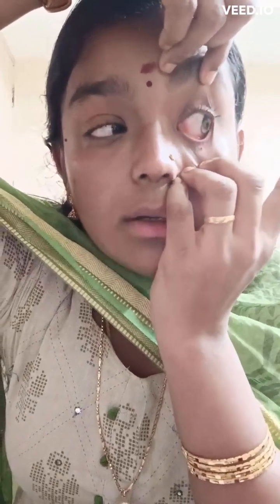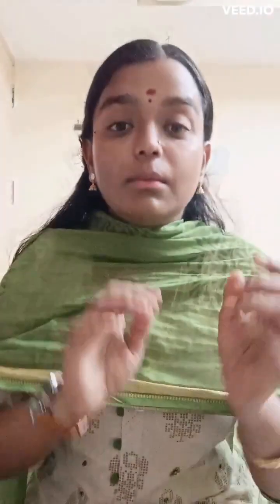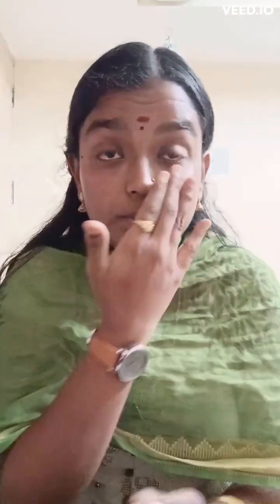After the insertion, we should advise the patient to look down, look right, look left, look up, and then release the eyelid slowly. We should ask them to blink to make them comfortable. We will also provide them a tissue before doing this procedure.